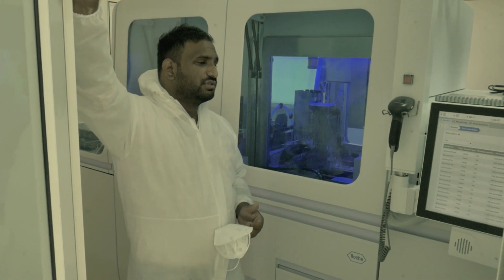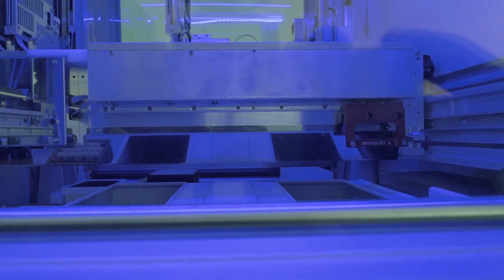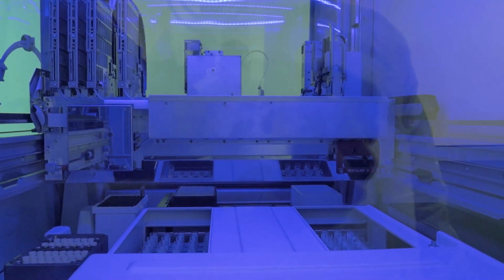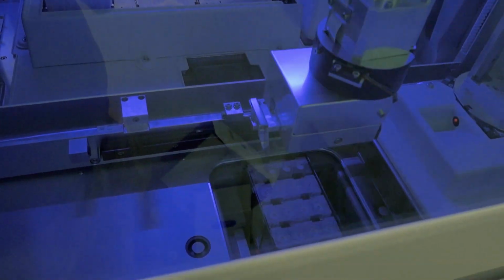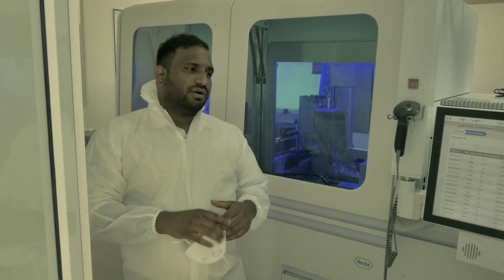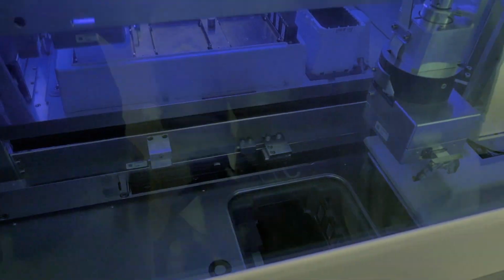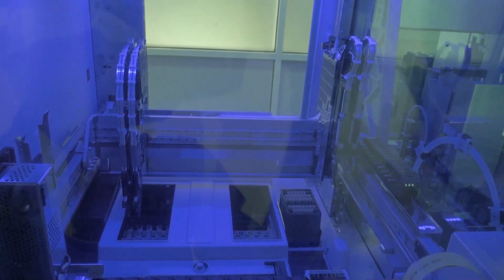The turnover time of this particular machine is about 3 hours. It's 2.5 to 3 hours. So basically, all you need to do is add the sample into a secondary tube and just place it in the machine, and it does everything else. So whatever could happen by a human, any errors, whether a mixing error or an error where you can confuse two samples, that will not happen, or any false positives, because everything is done by machine and everything is precise and calculated. If there's any problem, the machine will detect it and identify it as invalid.